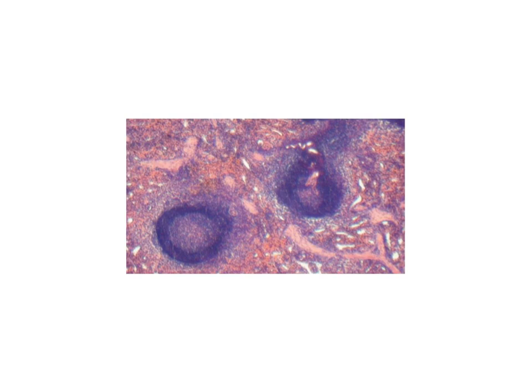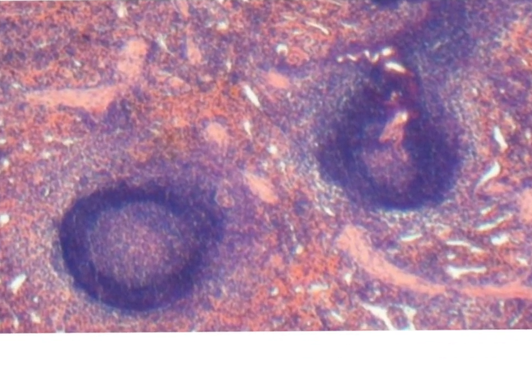Also, this is a picture of the spleen, and you can diagnose carefully the presence of the follicles scattered throughout the section. And if you look at any follicle or most of the follicles, you can see the follicular arteriole, mostly at one side of the follicle, and in between you have these blood sinusoids, and this is the structure of the red pulp.